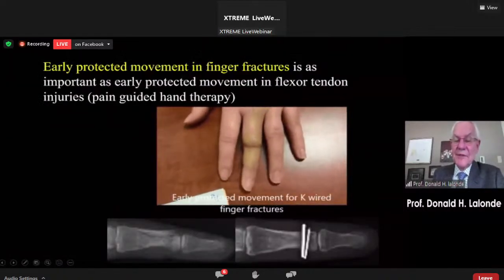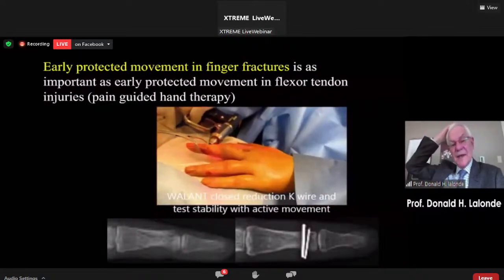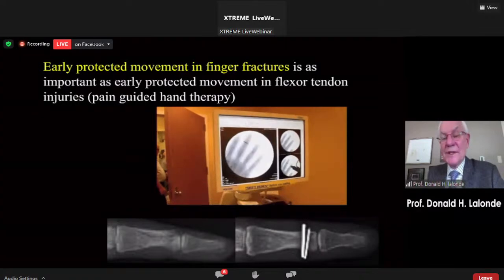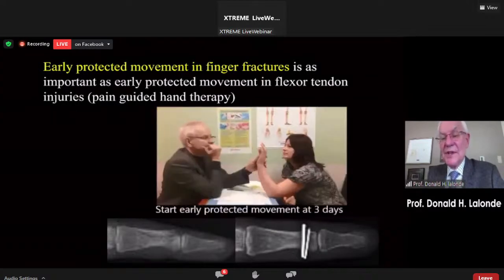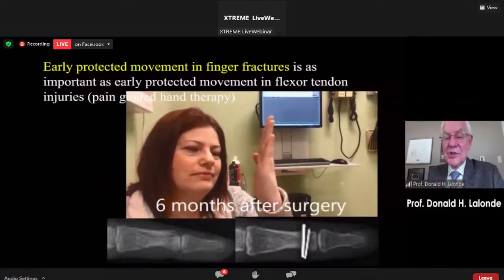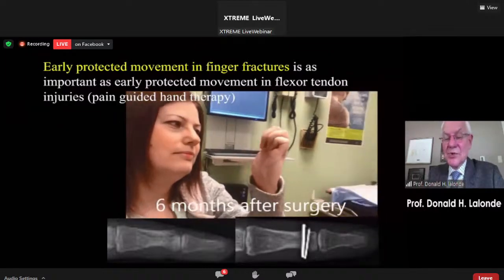This one is a middle phalanx fracture with rotation, but we do exactly the same thing. Field sterility in a minor procedure room. None of these cases went to the main operating room. Not one of these cases went to the main operating room. Even the osteotomy, I did that in a minor procedure room outside the main operating room. We removed the K-wires at 2 weeks when the fracture was no longer sore to palpation. So in this case, we took out the K-wires at 2 weeks because she was healed. And there she is at 6 months after surgery.